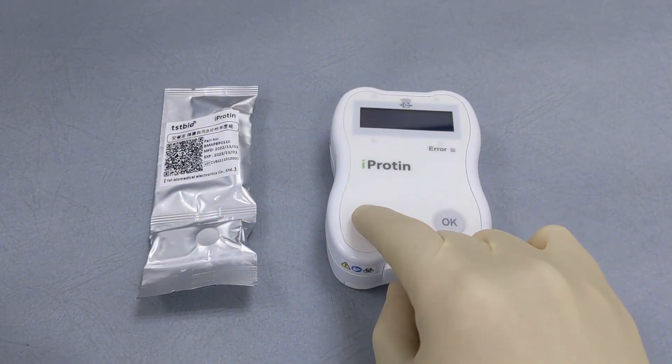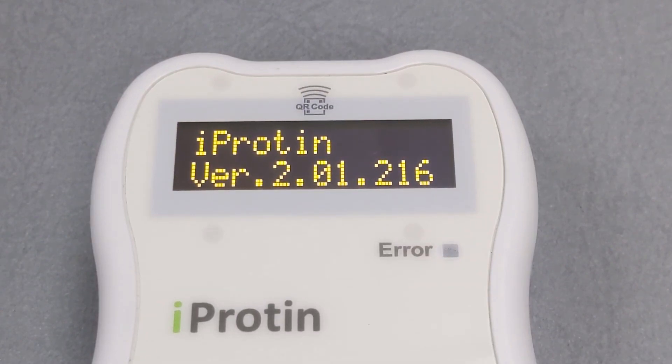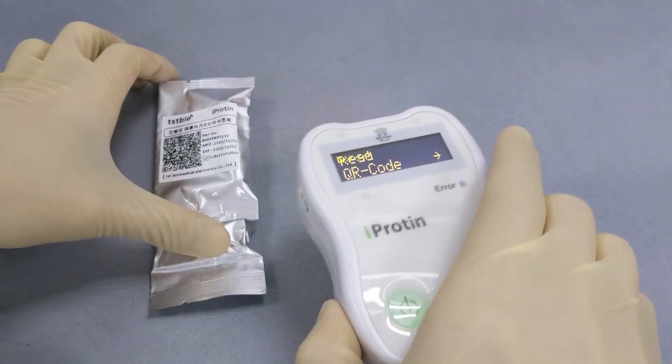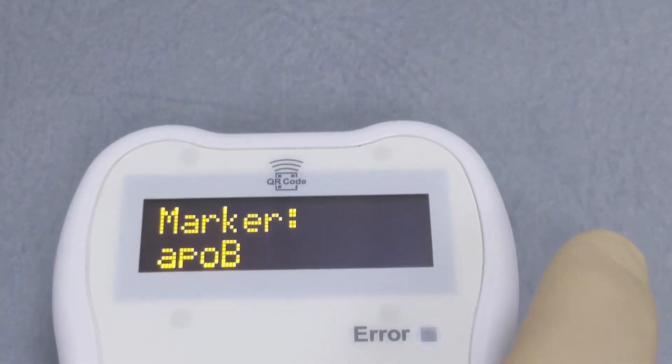Press and hold to turn on the iProtein reader. Confirm the version of the reader. Scan the QR code and confirm the current test item.